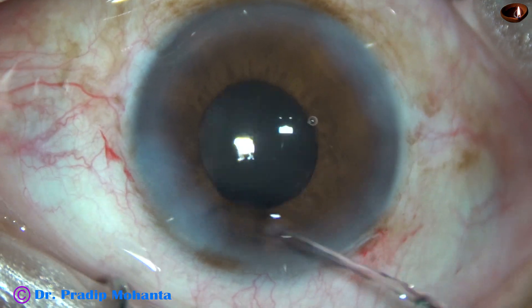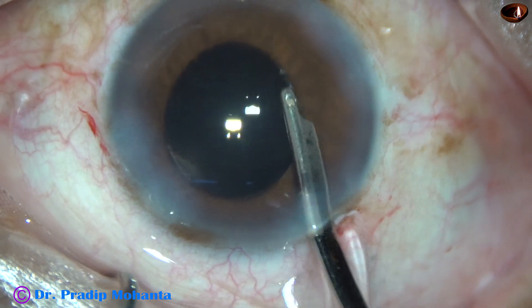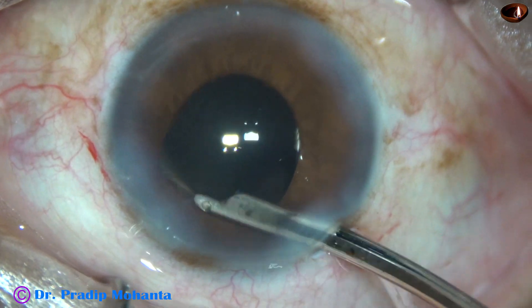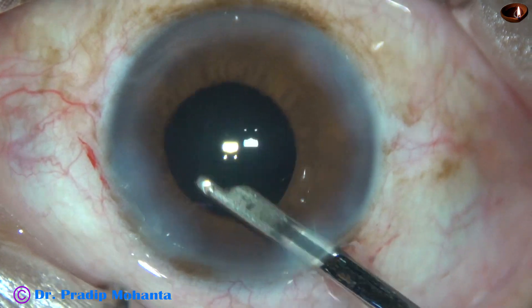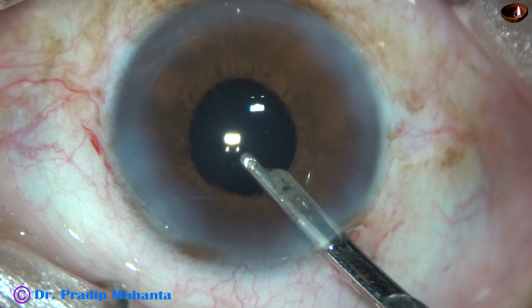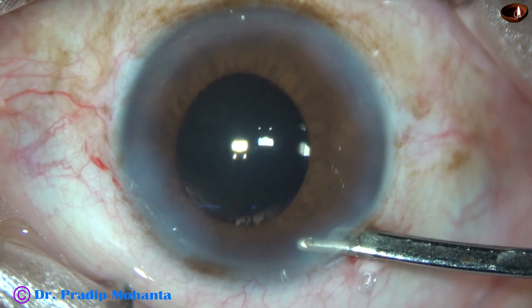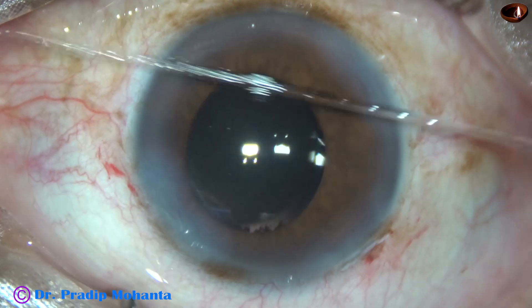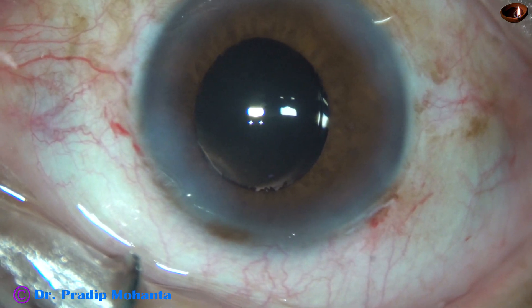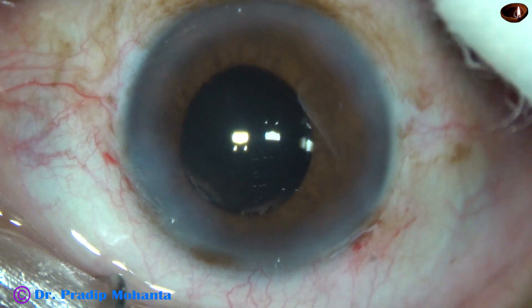The sideports are closed by hydrating the corneal stroma on either side of the paracentesis incisions. We are towards the end of this surgery. A thorough irrigation of the anterior chamber is done to remove all the Viscoelastic sticking to the corneal endothelium. The anterior chamber is formed very nicely. The integrity of all the wounds are checked. A few drops of moxifloxacin are applied over the ocular surface. The case is concluded.